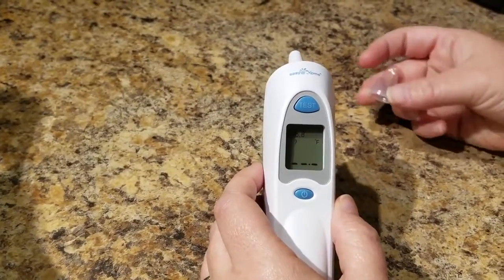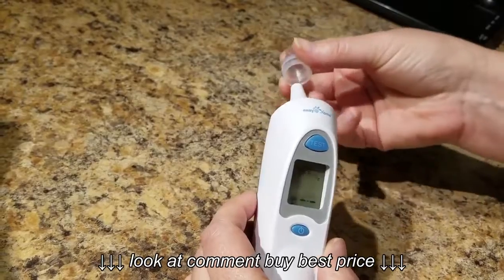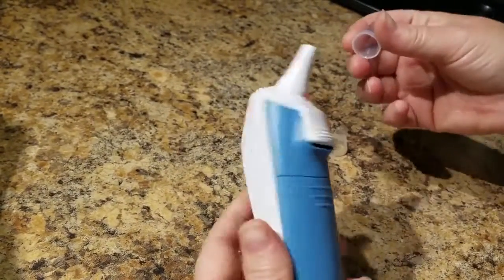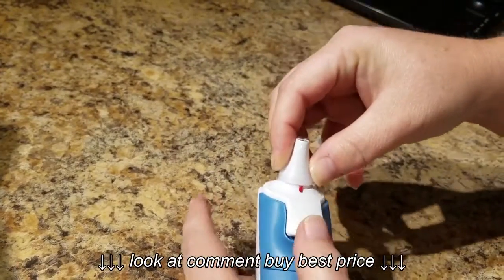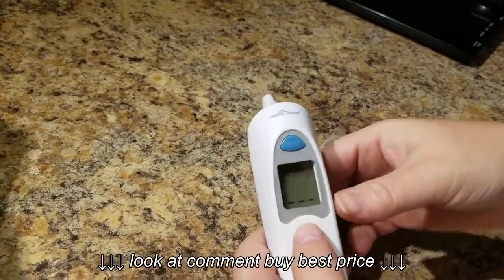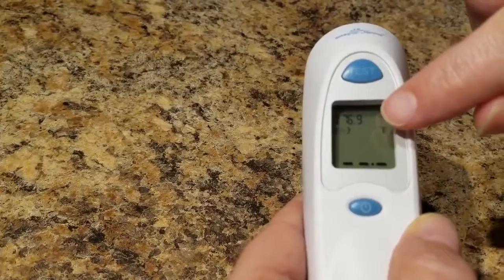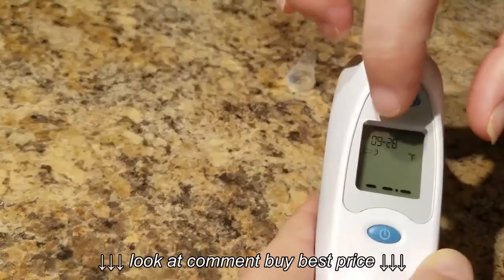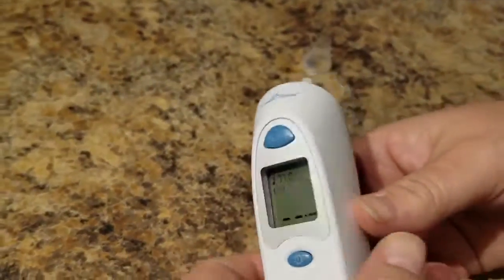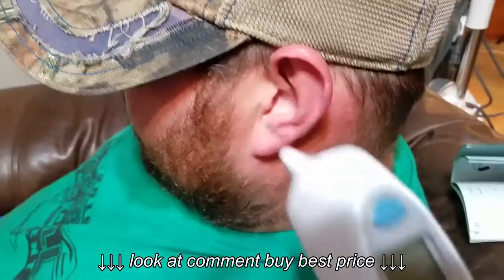Alright, so this thermometer came with a set of probe covers so that it's sanitary, so you don't cross-contaminate when you use it on different people. And so basically, to put it on, you just pop it on or pop it in place, and then when you look on your display, there's going to be a little icon next to the ear, and that'll indicate that there's a cover on there. Now to remove it, you just hit the button on the back and it releases it.